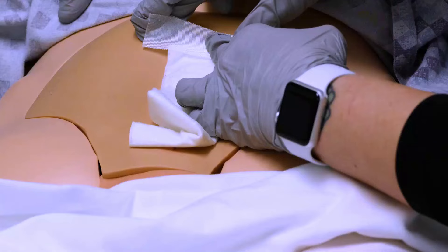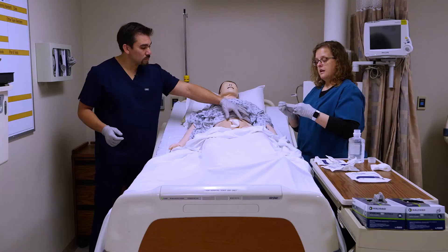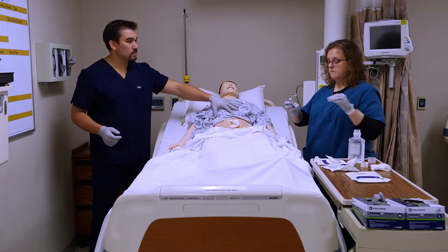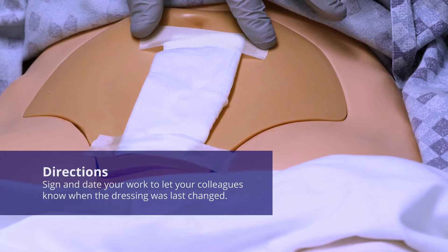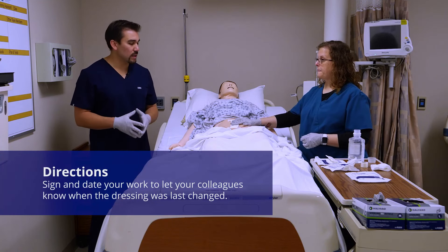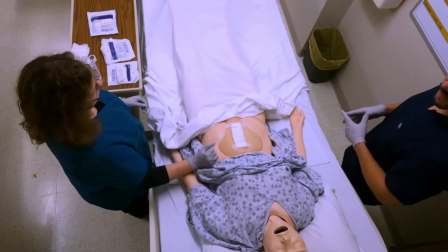But if somebody's just laying in bed, you're going to use as little tape as possible to try to keep them from having skin issues from the tape. And then one of the last things we do is we always make sure to sign and date it, so that the other staff would know when this wound dressing was actually changed. Always sign your artwork.